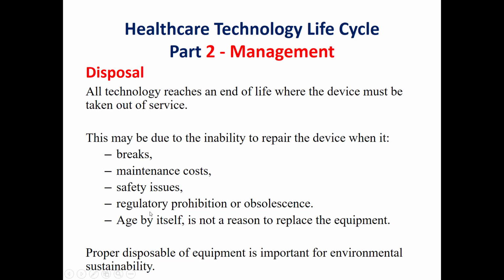Another reason is regulatory prohibition or obsolescence. When the device becomes obsolete, a notification will be received from the vendor or supplier that this device is obsolete, and there is a limited time before it should be removed from service.